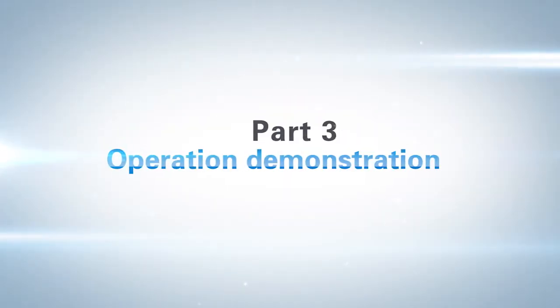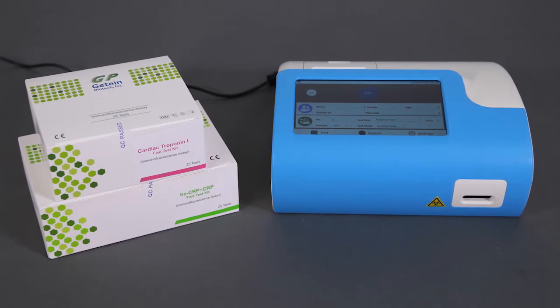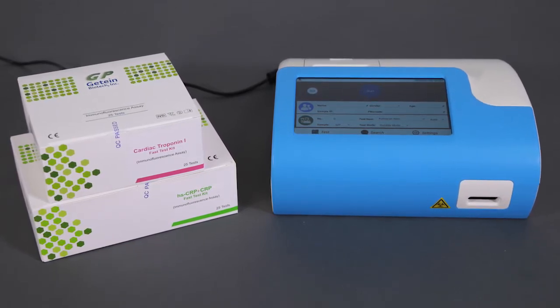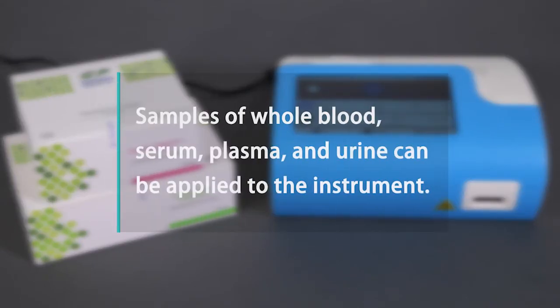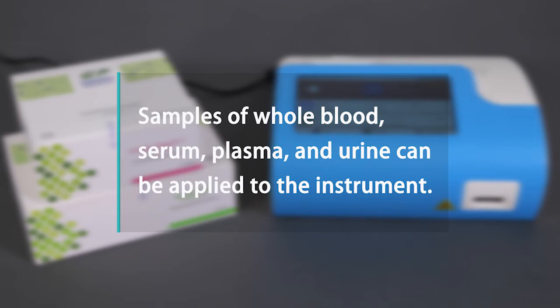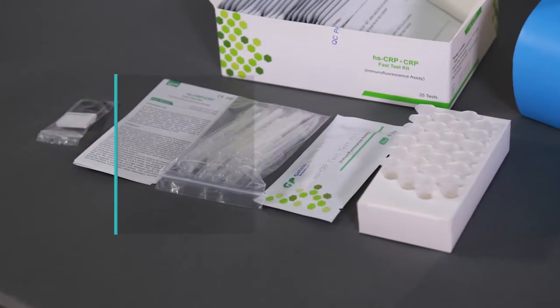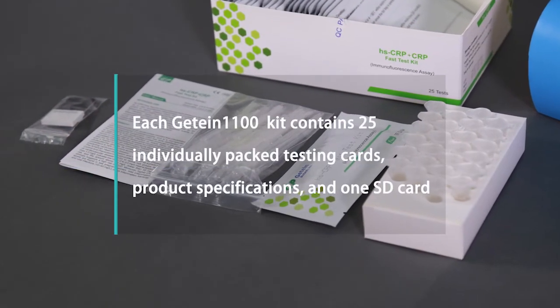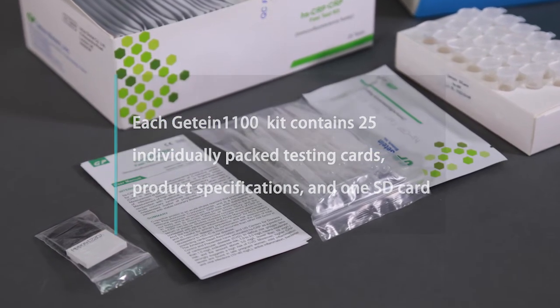Part 3: Operation Demonstration. The Getein 1100 Immunofluorescence Quantitative Analyzer shall be used with matched reagent kits as listed in the table below. Samples of whole blood, serum, plasma, and urine can be applied to the instrument. To ensure the accuracy of measurements, please allow 20 minutes of warm-up time before testing. Each Getein 1100 kit contains 25 individually packed testing cards, product specifications, and one SD card.